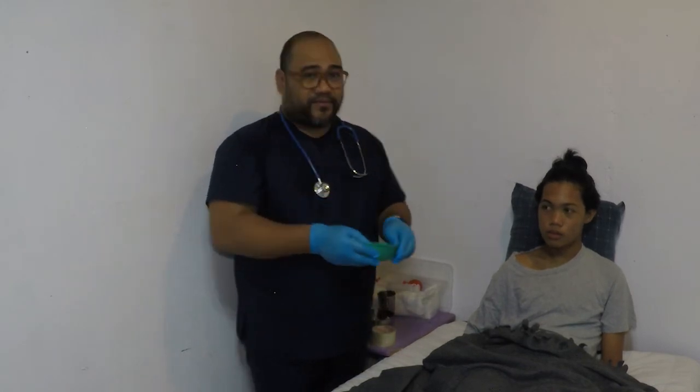Okay, so we just have to take off our gloves and perform hand hygiene to prevent spread of infections. Then we will now record the date, time, and the client's condition on the chart and be alert for complaints of discomfort. Distension or nausea may be experienced after removal. So you have to check that after you remove the tube. Then sign the chart to provide continuity of the care and maintain professional accountability.